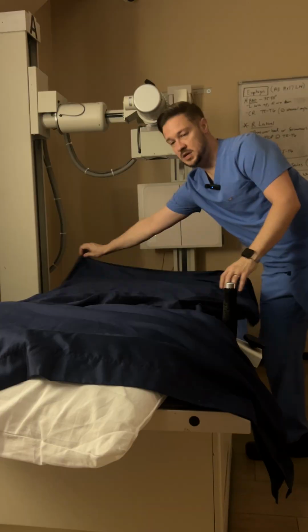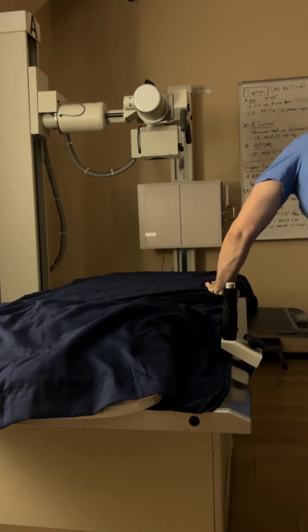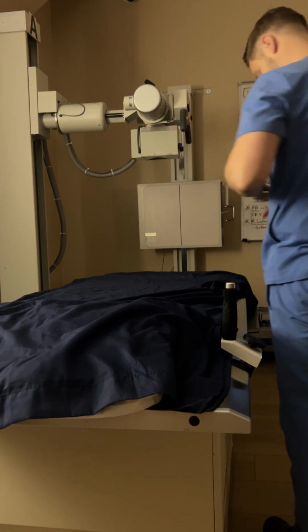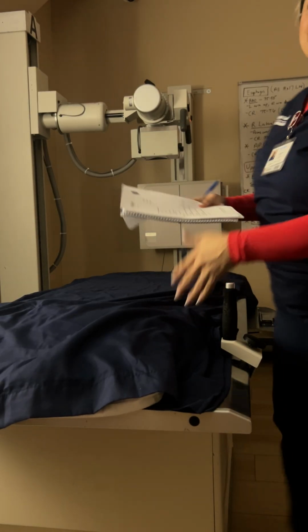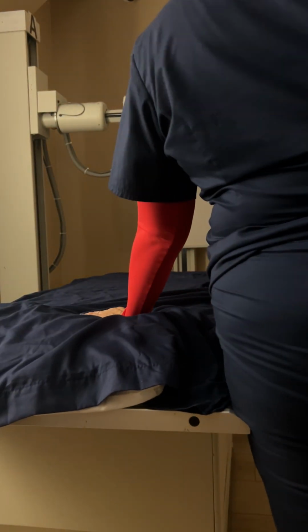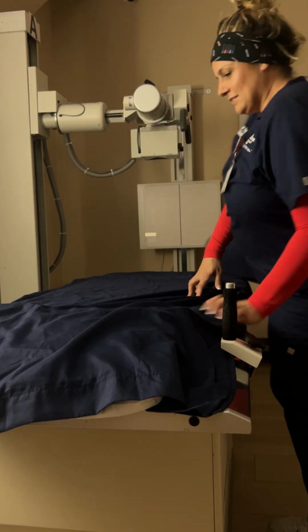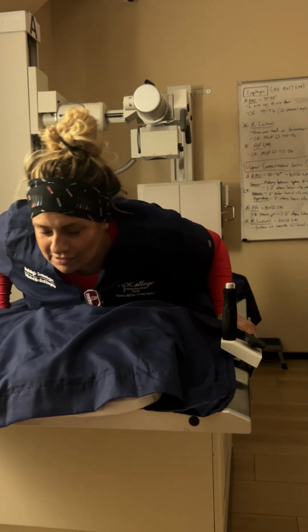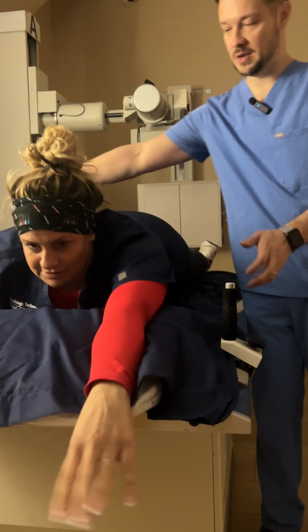Okay, who wants to be the patient? Great, we're doing great. I'll do it because I don't feel good anyway, so laying down sounds perfect. I'm going to put my head right here. Lay on my back. No, lay on your stomach. Okay, so left arm is going to be up, excuse me. Right arm is going to be down.